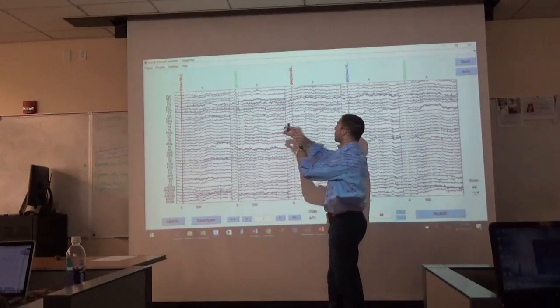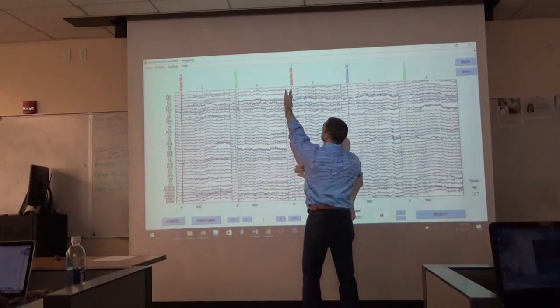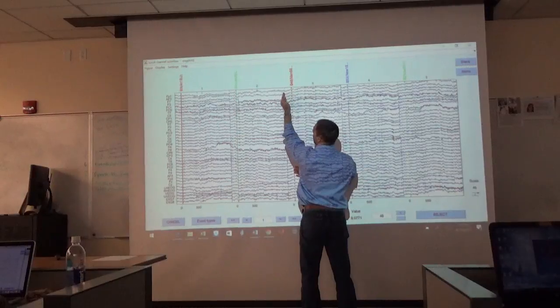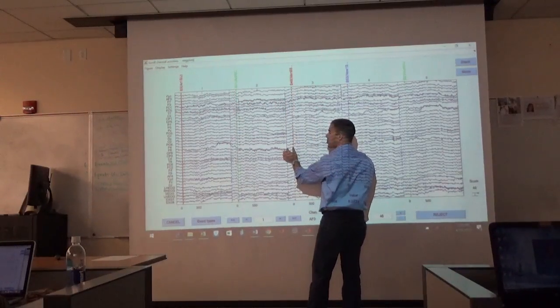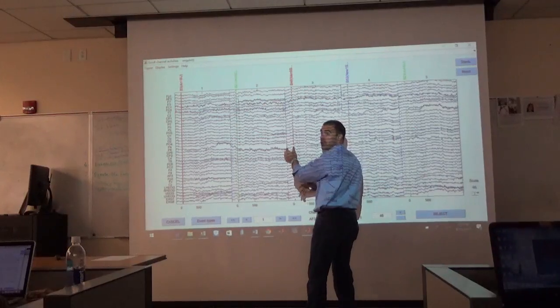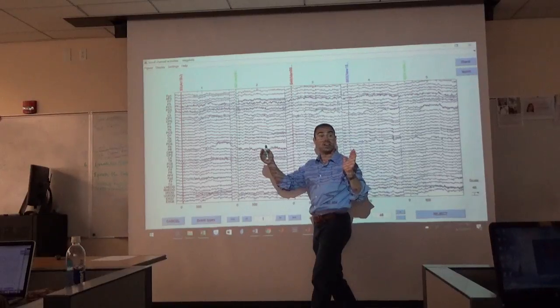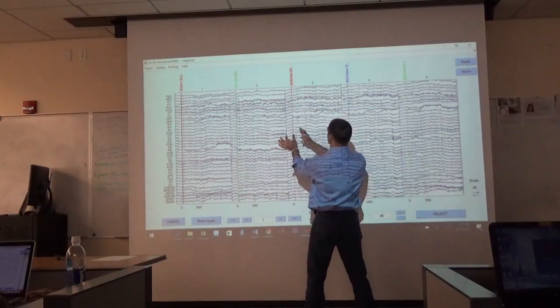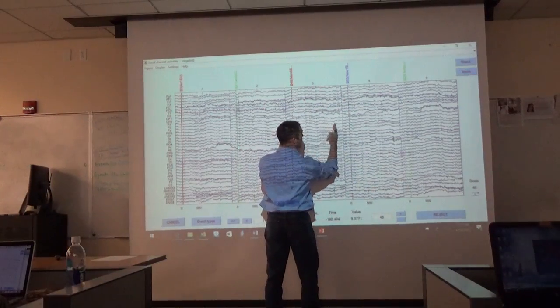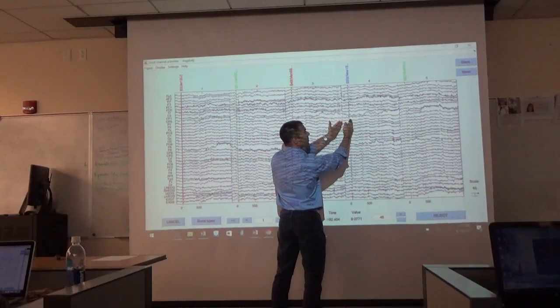Now they denote the same information of when the event happened, but there's this blue vertical line a little bit beforehand, right? So this is our stimulus onset. This is our 200 milliseconds beforehand. Remember when we epoched the data, we created those windows? This is our -200 millisecond pre-stimulus baseline. It goes 200 milliseconds here, and then it goes 1500 milliseconds here. And then we start the next 200 milliseconds for the next trial.